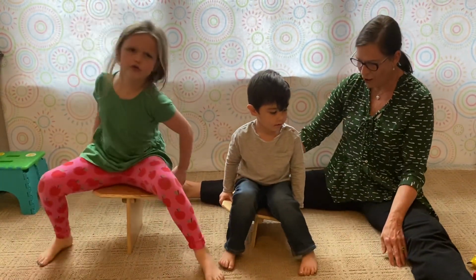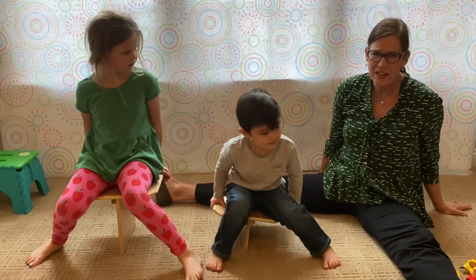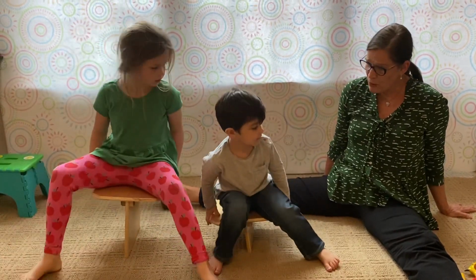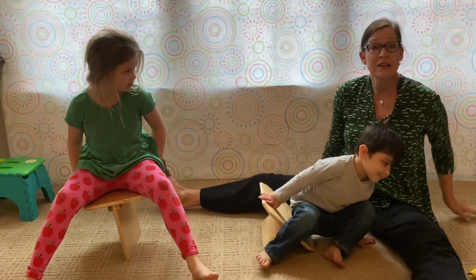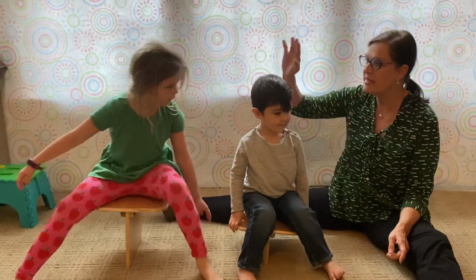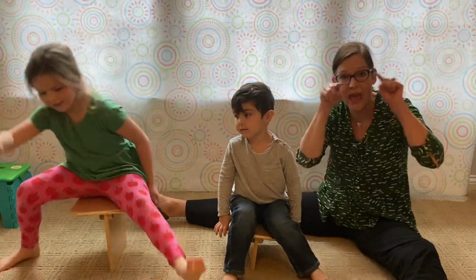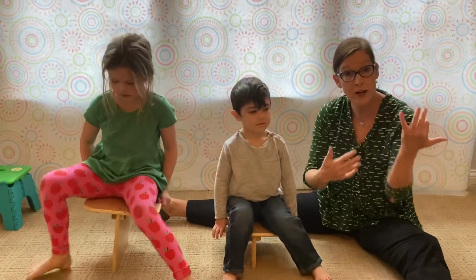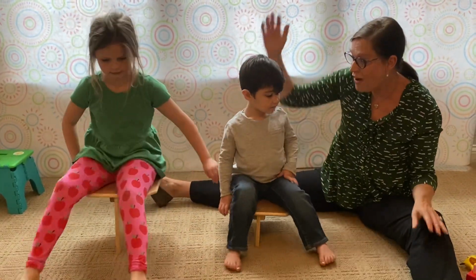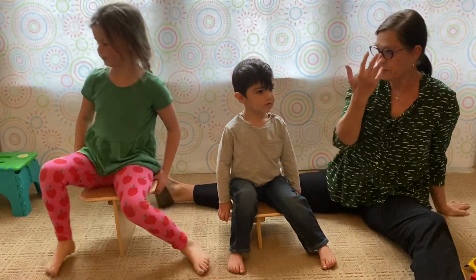So if you slide, go. It's timber. Wobbly. It's wobbly. How does it feel, Ez? Good. It feels good. Can you slide off of it and go boom, boom? So his arm came out into protective extension, and he's keeping his head upright. It's not falling to either side. He's keeping his head upright, and his eyes, what could be called optical righting, or head righting, or trunk righting, are trying to keep the world in a very stable viewpoint.